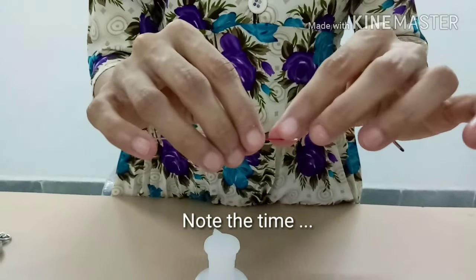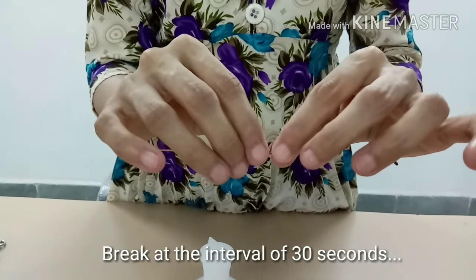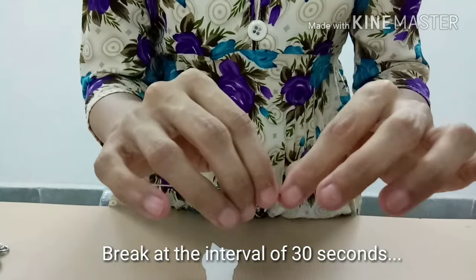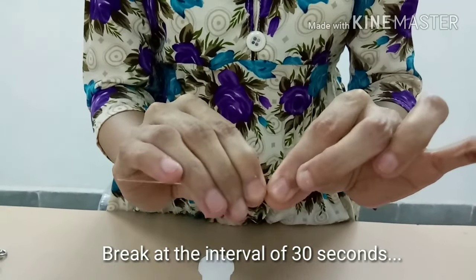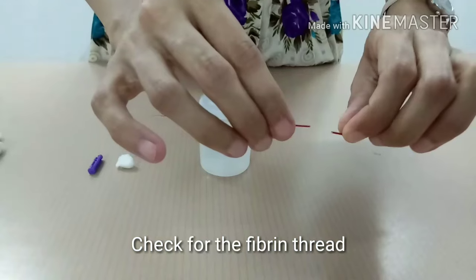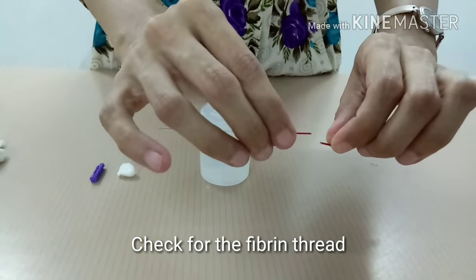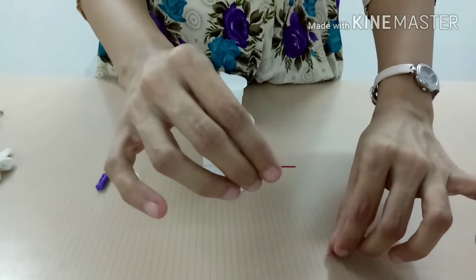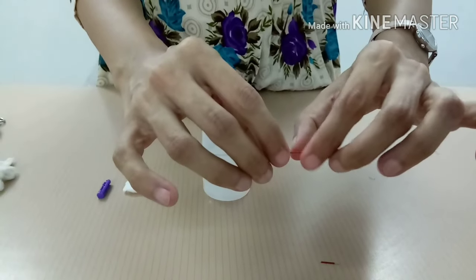Break about 1 mm of the capillary tube from one end after 30 seconds and check for the fibrin thread. If the fibrin thread is not seen, repeat the procedure at every 30 seconds till fibrin thread appears.